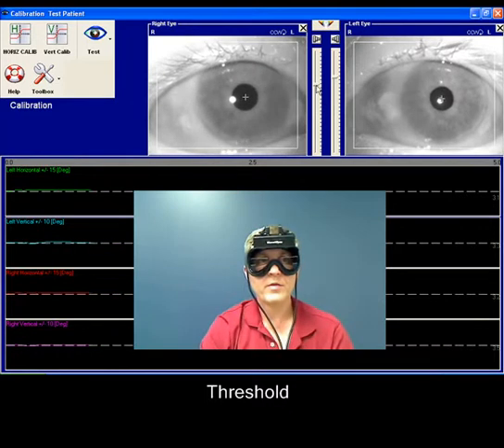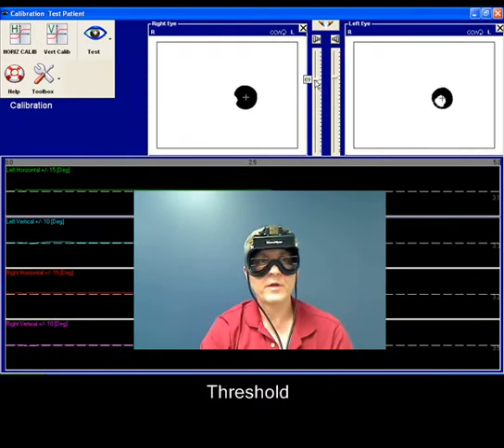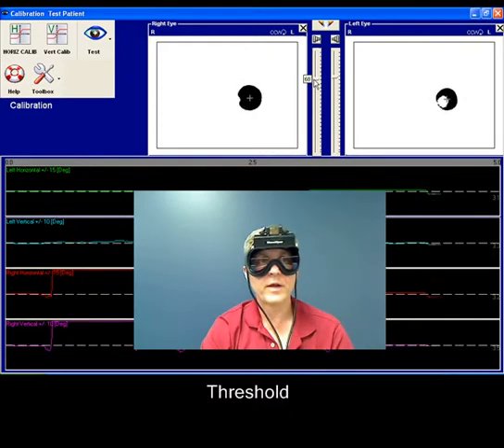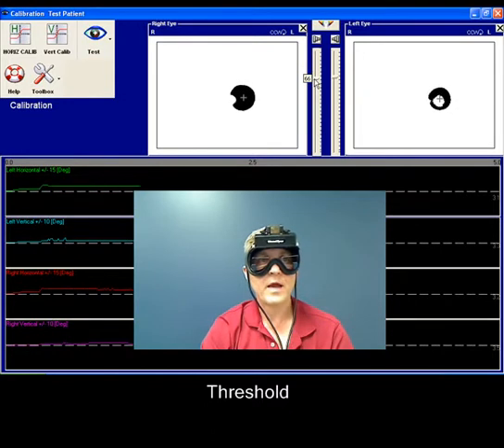And finally, the threshold. You use the left mouse button, hold it down, and you can adjust your threshold. You don't want the threshold too bright, and you don't want the threshold too dark. You want it enough to where you can see the pupil of the eye. You can check your threshold by having your patient move their eyes.